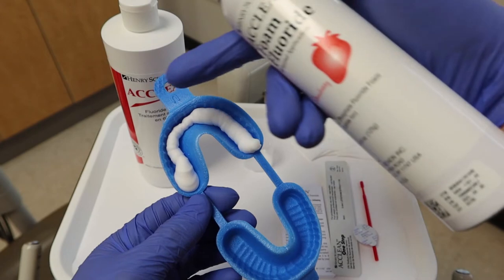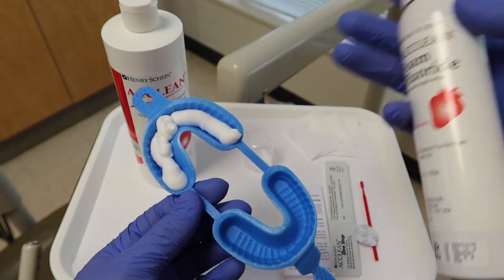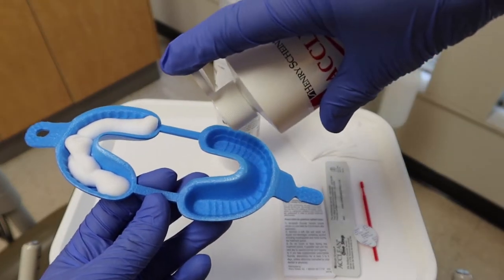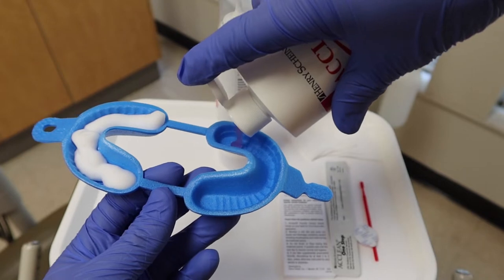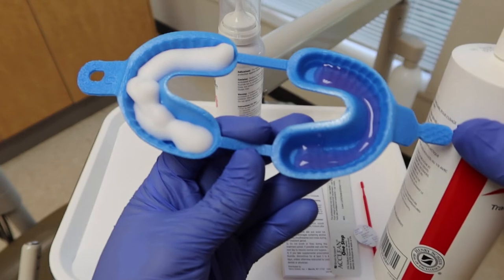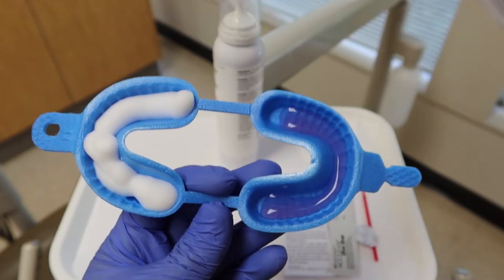If you have little irregular areas compared to others, you can give it a little bit more. But that's just about all you will need. With our gel, we can go and place this — you're not going to want to put too much, just enough that it fills that tray. And just like that, now we can see our two different methods: gel versus foam.